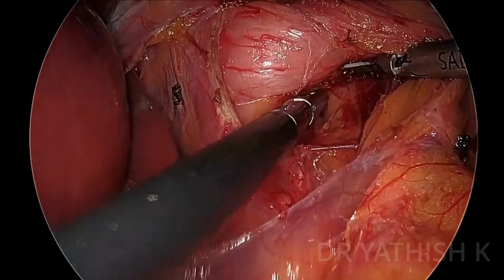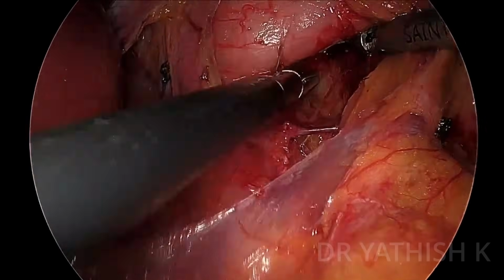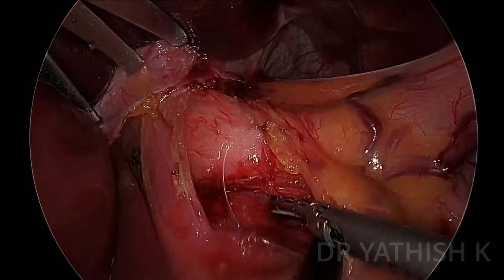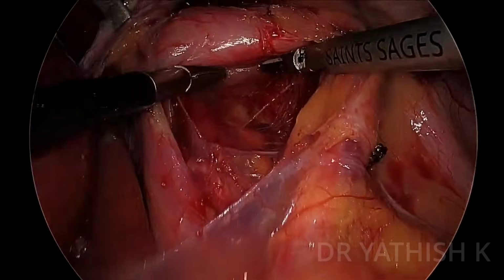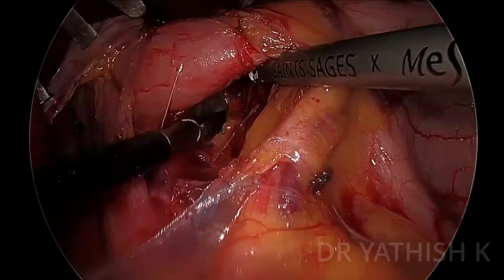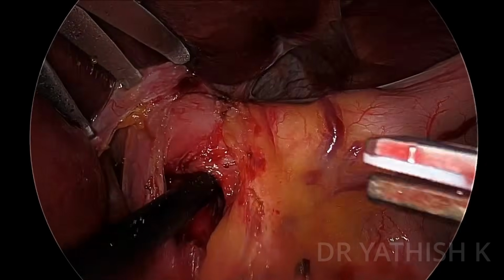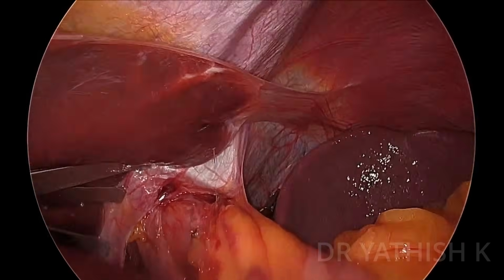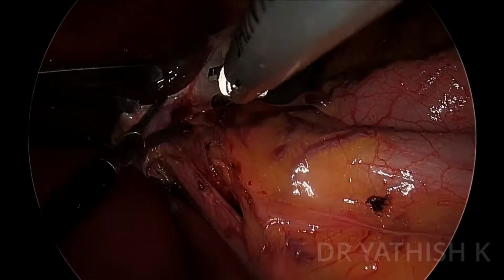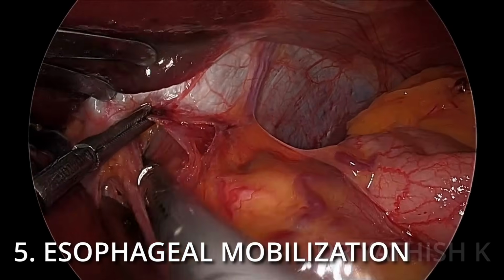When you do the retroesophageal window, you have to be more careful about your posterior vagus nerve, because there's always a chance that we end up sweeping away the posterior vagus. Instead, we have to sweep the posterior vagus towards the esophagus and lift it up altogether. Like I said before in previous videos, these are the embryological planes, basically a bloodless field where you can create the planes.